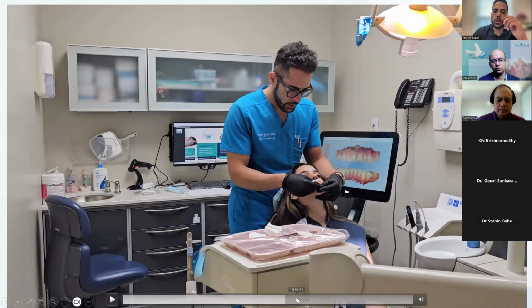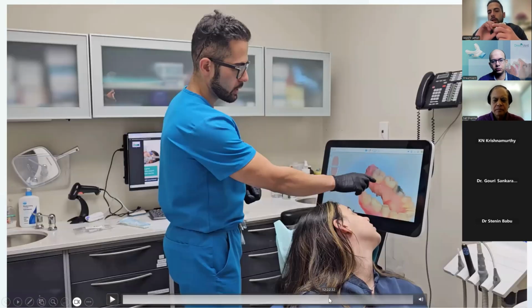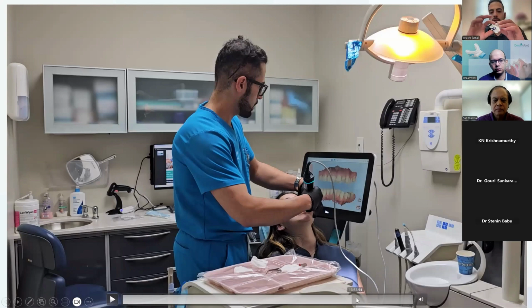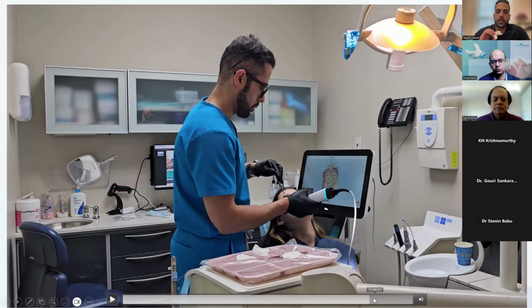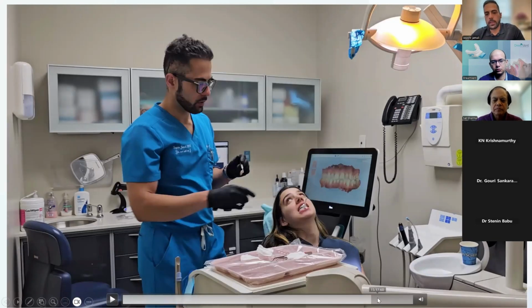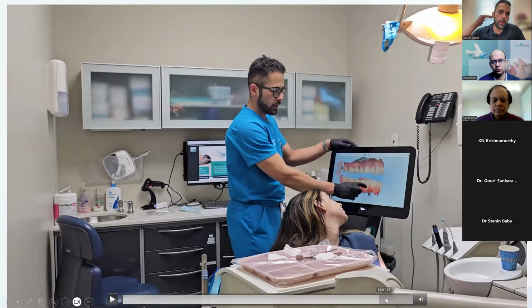And also for the bite, with the bite fork, one important factor is that we need at least 5 millimeters of the interocclusal distance for allowing to place the DreamVent and the dedicated airway space. So we need that 5 millimeter clearance all around. So that's why when we scan the bite with the bite fork, right now you see it in the image, that's the way the scan is going to show up with that amount of clearance in the desired bite position. So again, we have the maximum intercuspation bite and also the bite with the 5 millimeter clearance.